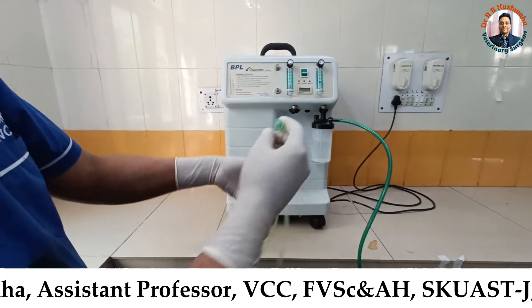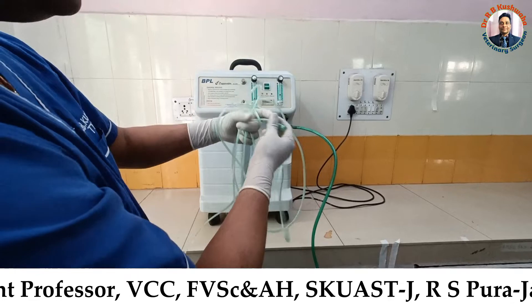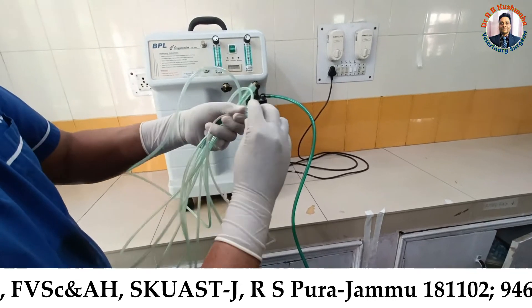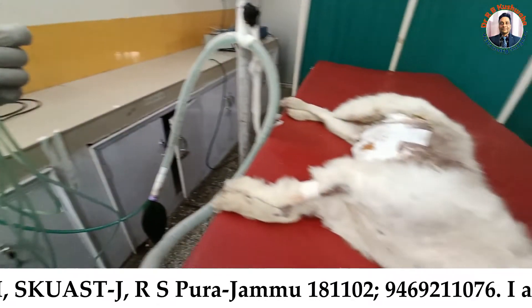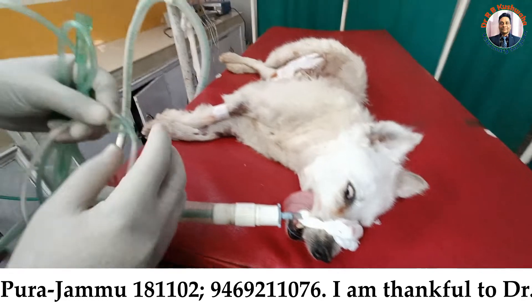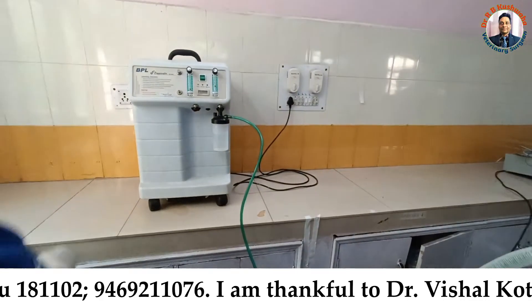Companies supply this tubing system for human beings, in which we put this one here and these two tubings we put in the nose. Suppose for this animal, we can put it, but with this method we cannot provide the maximum oxygen. So this is a metal bit improvisation.